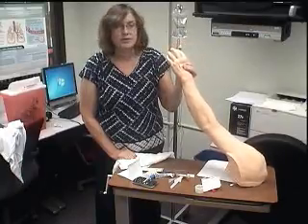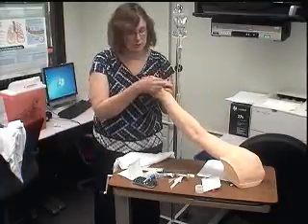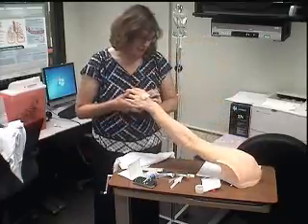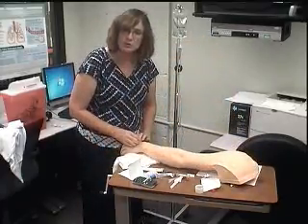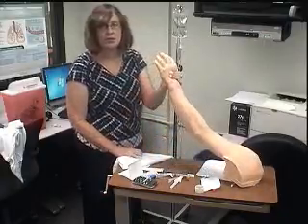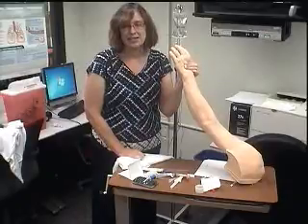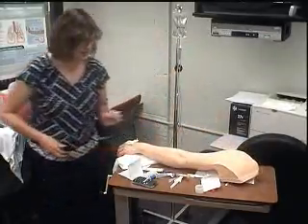So I'm going to sit there and hold it until I think the bleeding stopped. And then I can take a little peek and see if it stopped. I can put a little Band-Aid on, or I can just put a little piece of tape on this right then and there. And that is how you take that out. Then you need to document it. So when I document, I'm going to say what I removed. I removed a 20 gauge catheter from the left hand. Catheter intact. That's important to note. And that's the IV checkout.